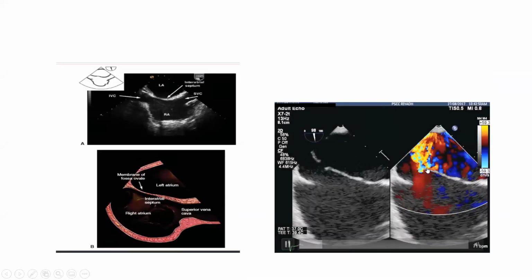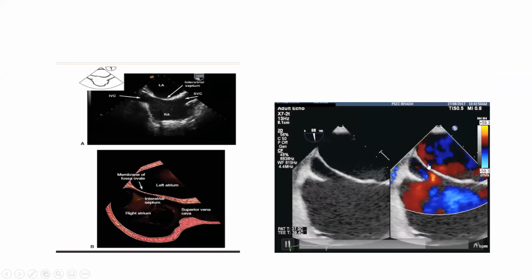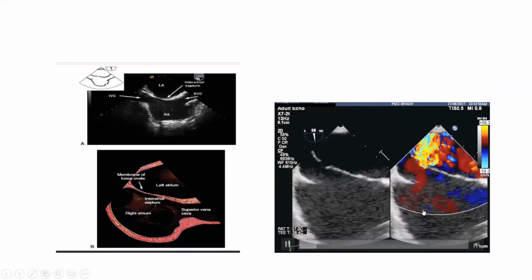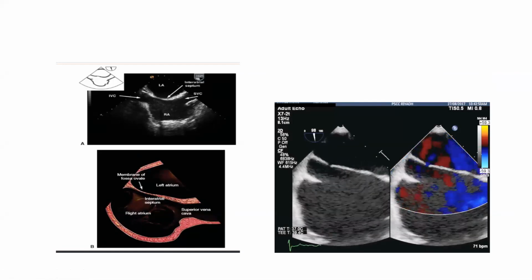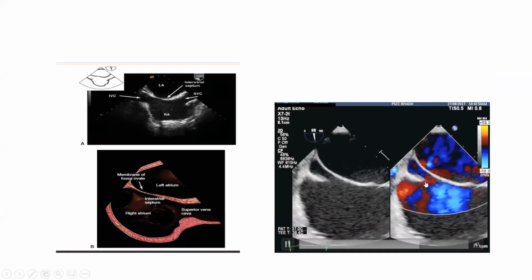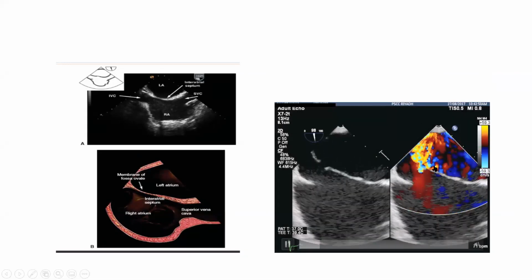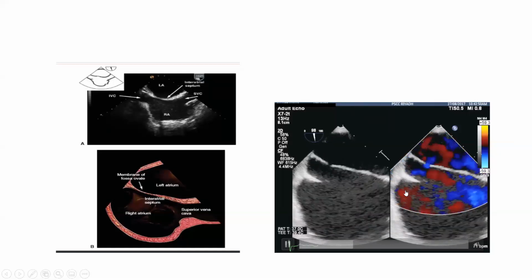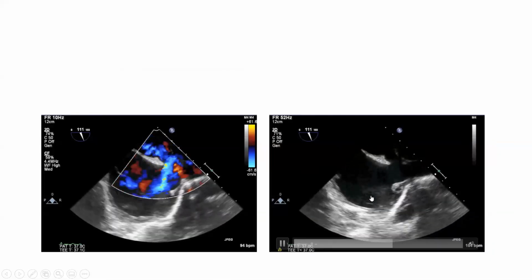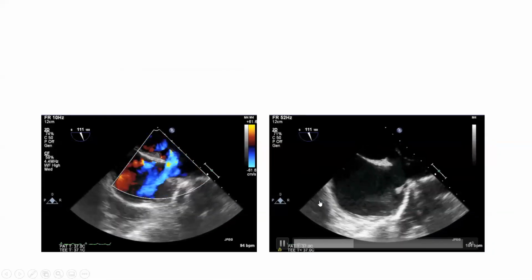Like this patient, there is an ASD. This is post mitral valve clip. So this is iatrogenic ASD, and the shunt is from the left to right or right to left? From right to left. Why right to left? Because likely the patient has pulmonary hypertension and the jet is going from right to left because of the severe pulmonary hypertension. Okay, if anyone gets it, he will be the star of this lecture, of the meeting.